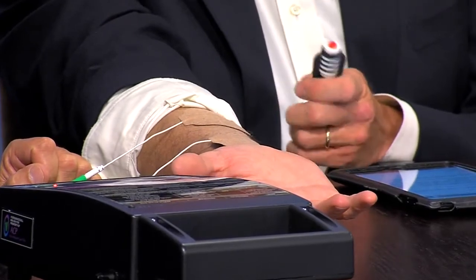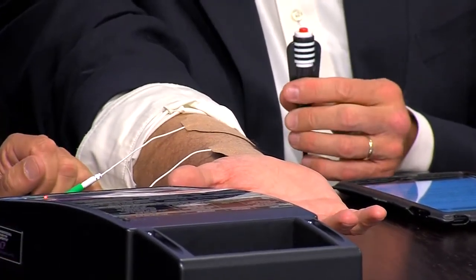Well, let me ask you this. I've seen stuff like this in TV commercials. Can't I just go out and buy one of these things and do it myself? No, it's a high volt current. This is specifically for wound healing. And that's where the additional training of anatomy and physiology and disease processes comes in. Because it makes it quite different than the traditional E-STIM that you would see for muscle spasms and that sort of thing. I understand. So that's what happens. David, Nancy, thank you so much for joining us.